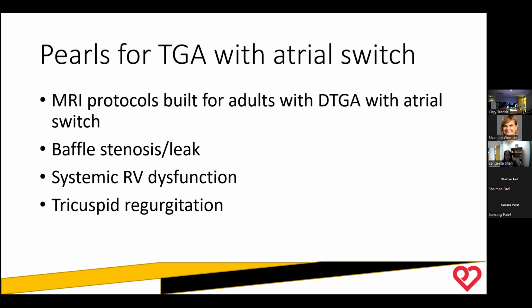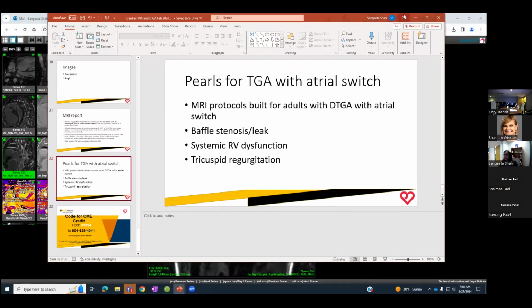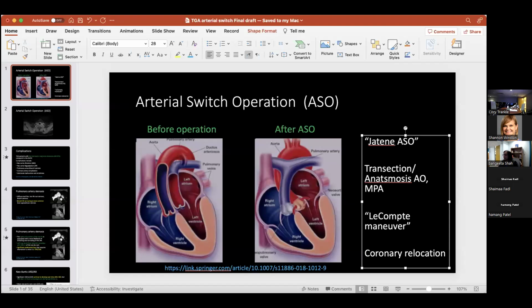So I'm going to end with DTGA, atrial switch, and turn it over to Dr. Fadl, who's going to talk about arterial switch. Thank you so much, Dr. Shah, for sharing such wonderful review for the atrial switch. I'm sharing my screen.